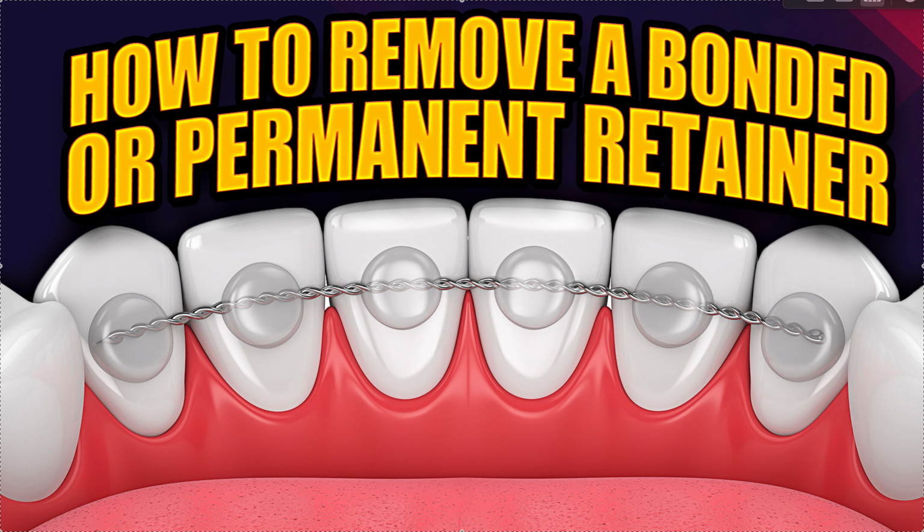It depends on how it went on, how it's constructed, what it's made of, how it's bonded, the periodontal status of the patient, the roots. There's so many things that go into it. So essentially, the way I take it off is backwards from the way it got put on.